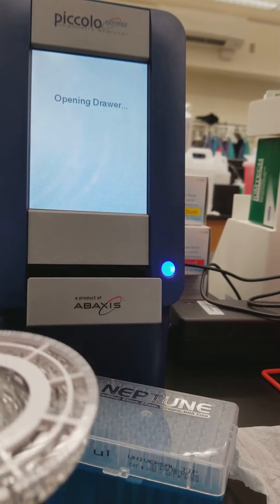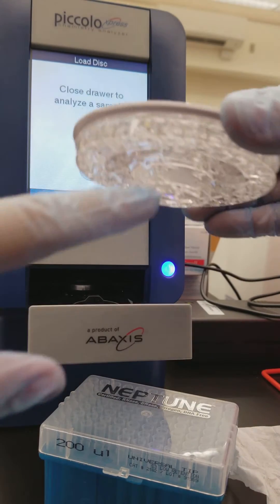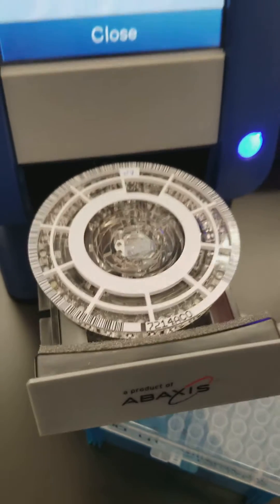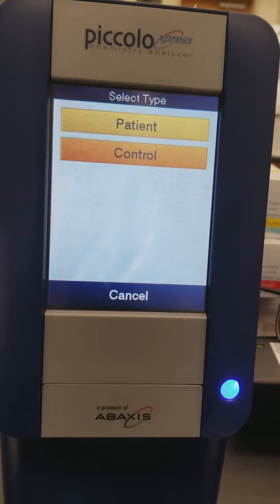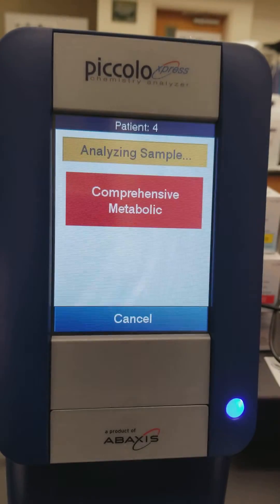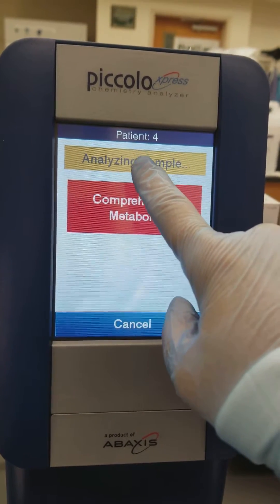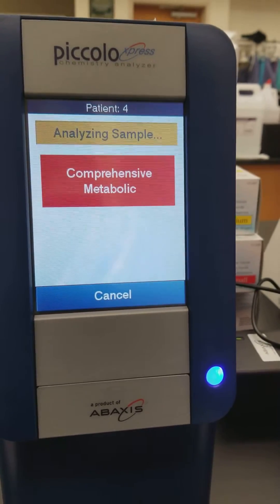Now I'm going to press Analyze. It opens the little drawer — there's a little lip here, it looks like a flying saucer. You put the little lip inside the hole, placing it in and making sure it's flush. Do not push this drawer yourself — hit the Close button. It's going to automatically analyze it, running the QC and everything first. This is not a control; I'm running a patient and I'm going to say that it's patient four. Now it's going to analyze the sample. It even tells you what test you're running — this is patient four running a complete metabolic panel. If I wanted to, I could cancel it, but I don't want to do that.